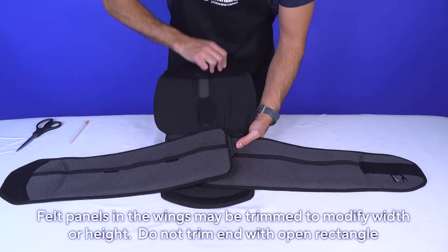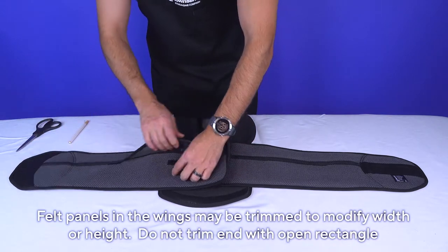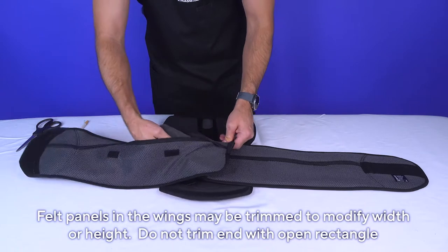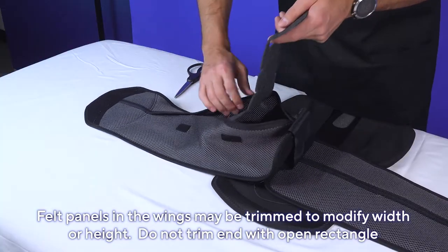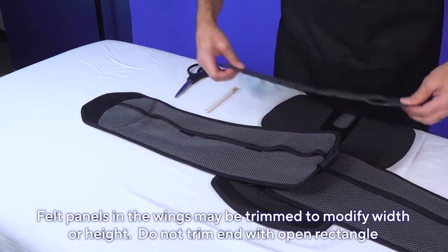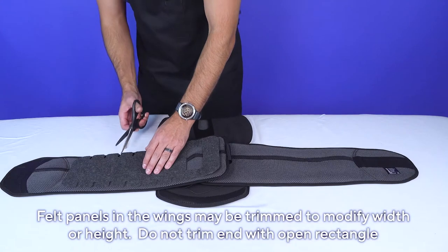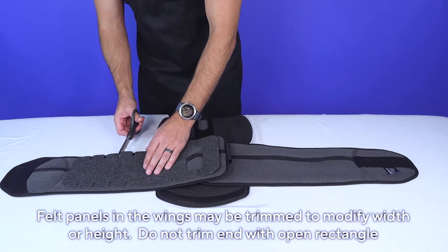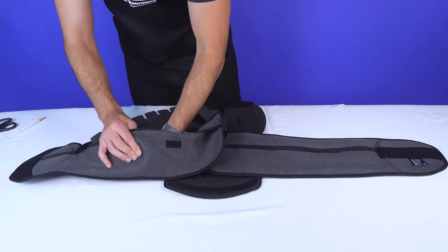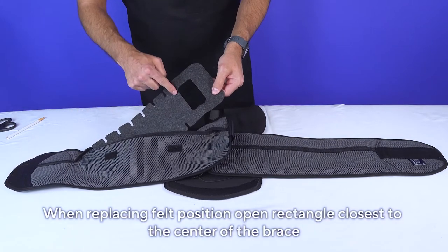Felt panels in the wings can be modified as well. To access the felt, open the brace and detach the Velcro holding the wing pocket shut. Remove the felt and modify the length and height. Use the notches as a guide to trim up or across, and do not trim the end with the open rectangle. When replacing the felt, be sure the rectangle is positioned closest to the center of the brace.